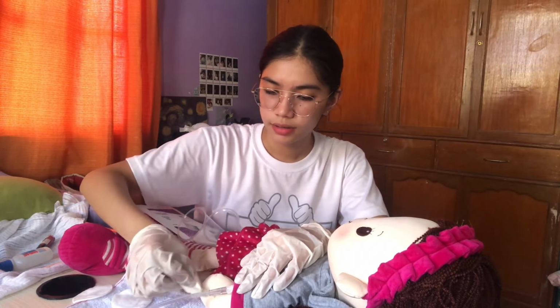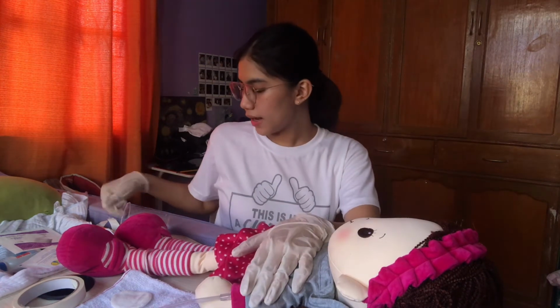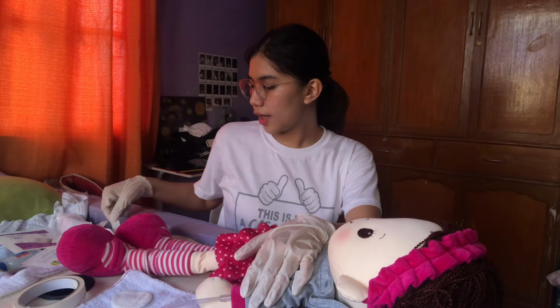Okay, ma'am. Nililinis ko na lang po yung IV site. Okay. Yan, ma'am. Retape the needle or catheter. So, for a butterfly needle, we will apply strips of tape to the wings of the butterfly using crisscross method.